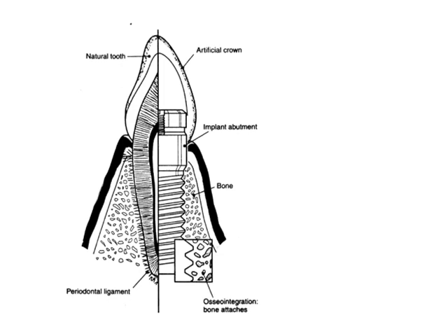So just notice in this picture the difference between a true tooth and a fixture. You might have to be able to identify something like this on an exam. So what's the difference between having a natural tooth and an implant? Well, obviously it's that fiber attachment, it's the loss of the PDL.